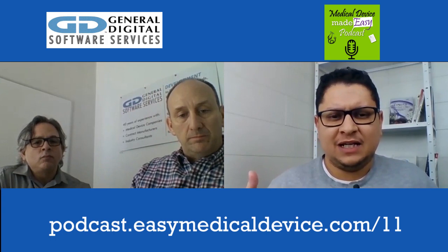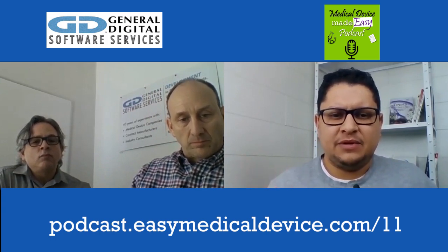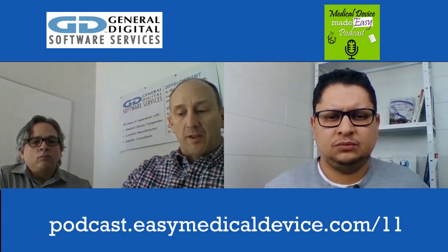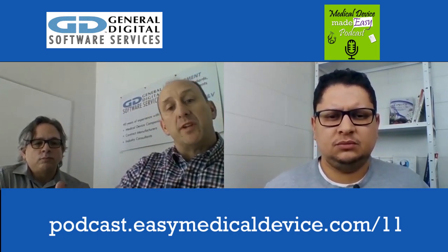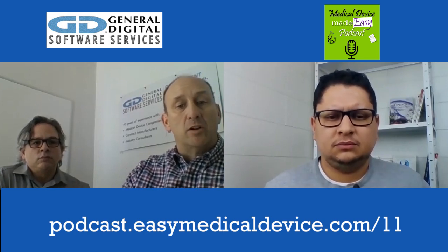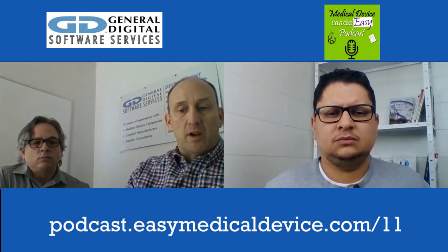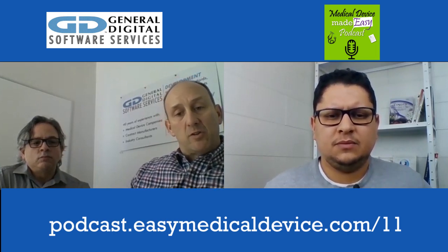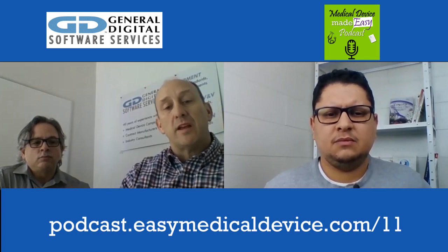And just to emphasize, we can talk about a medical device that contains software, or a software that is a medical device by itself. So it's the same process that we are following. Yes, it's the same process. Always start with the requirements, which is what dictates how you're supposed to code the device, whether it's a mechanical device or a software-only device. You still need to understand what it's supposed to do, so that when you're coding it and testing it, you make sure it's hitting the things that you said it was supposed to do.